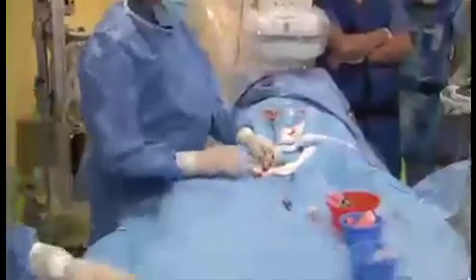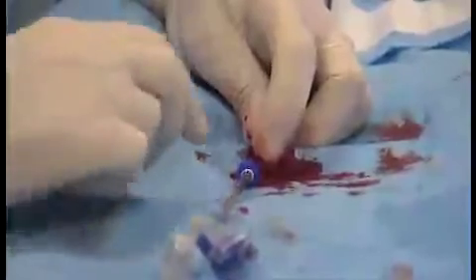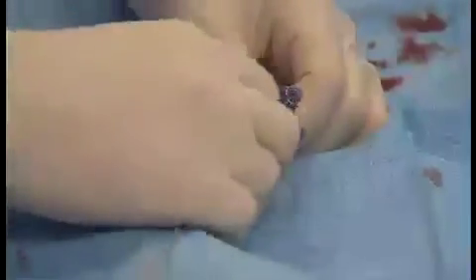You see? We see that clearly. Well, I don't want to bleed that much. I think this is the most simple way to avoid air entry without too much washing and aspirating, etc. So we connect the... Nice. How many times do you draw the dilator at the lower part, the upper part of the IVC? Well, I usually don't do this. I did not experience any problem in advancing the dilator up to the left atrium.